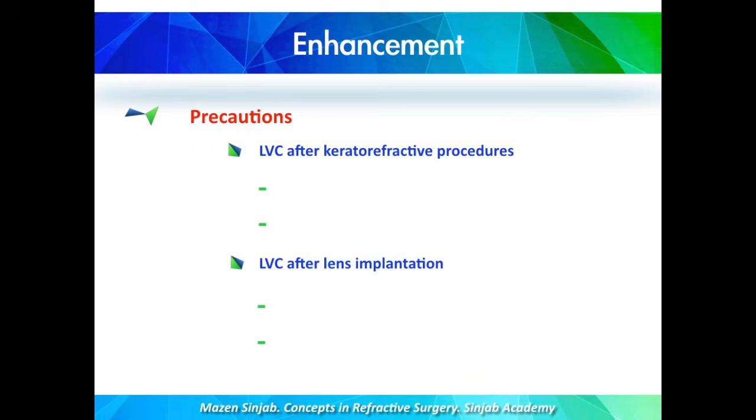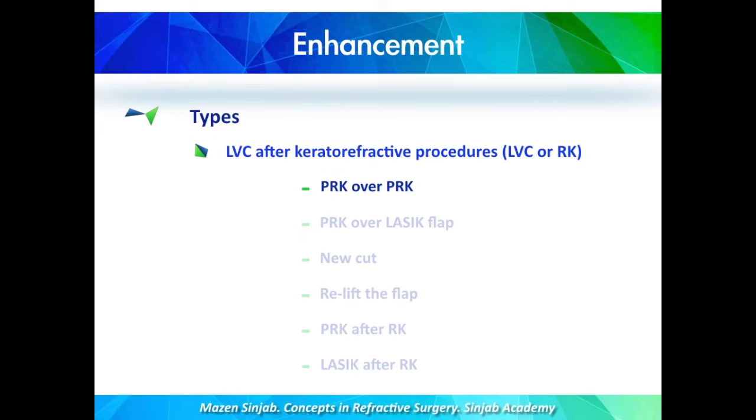However, there are precautions. If we do laser vision correction after previous keratorefractive procedures, there are two major complications, haze and epithelial ingrowth. And if we do laser vision correction after lens implantation, there are two major complications, which are the toric effect and the decentered ablation and its bad effect on this type of treatment. Starting with the PRK over PRK.